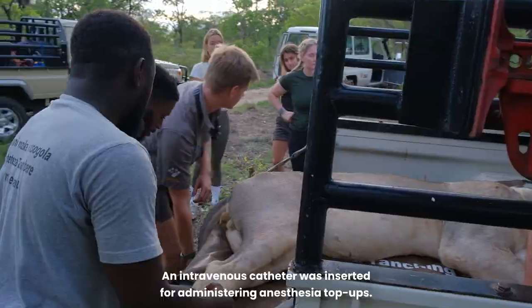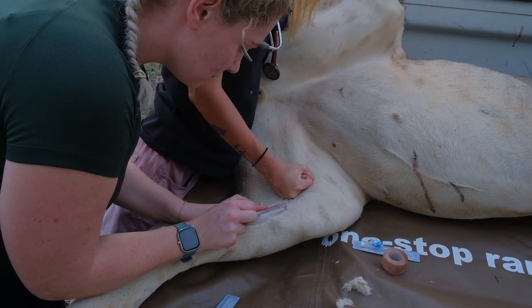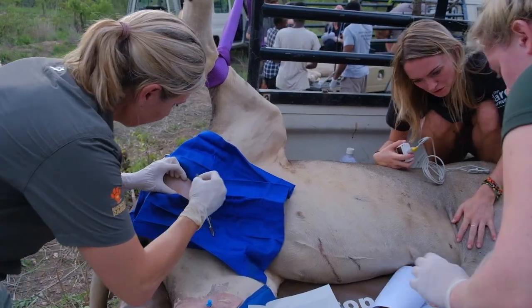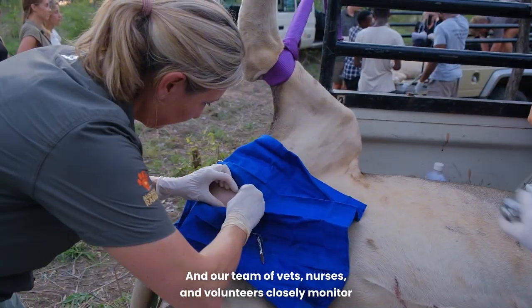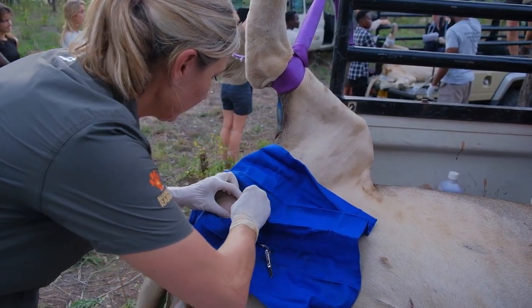An intravenous catheter was inserted for administering anesthesia top-ups. And our team of vets, nurses and volunteers closely monitored them throughout the procedure.